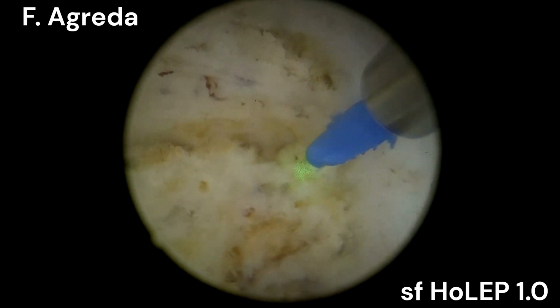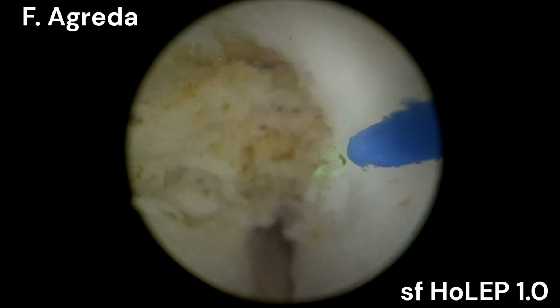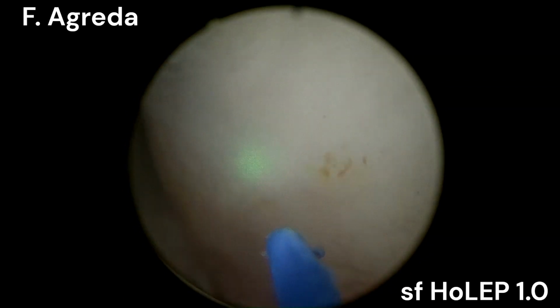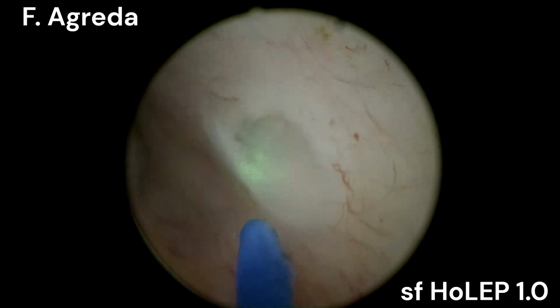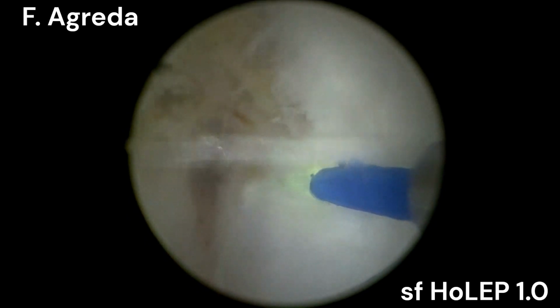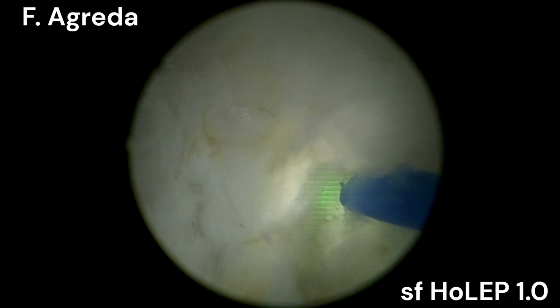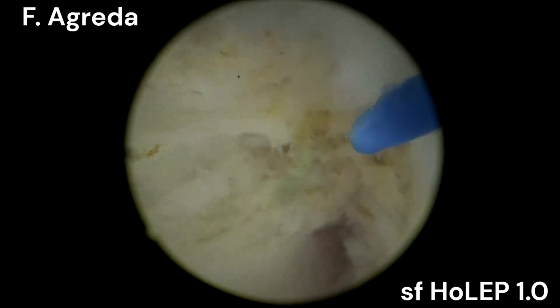and now I'm completing this dissection through the left part of the prostate of this patient. So you can see there's no lesion of the sphincteric mucosa, and now after we progress and we actually complete the liberation of the sphincteric mucosa in the anterior aspect, we go to dissect the left lobe. It's very easy now. Now we are completely sure that the sphincteric mucosa and main part of the external sphincter is free from tension from our dissection or from any kind of damage that we can produce by stretching or depithelialization. So we can progress.